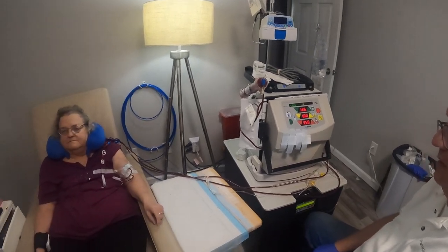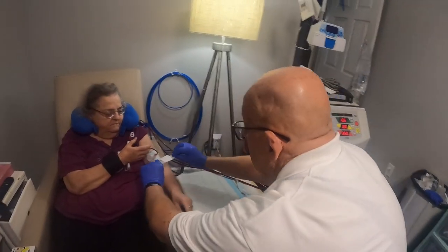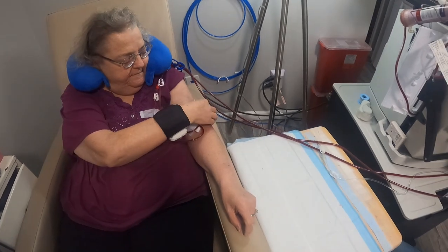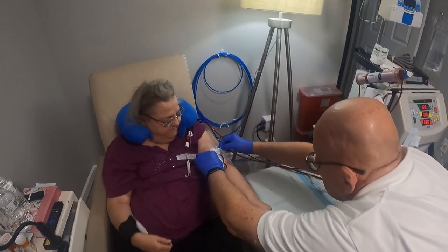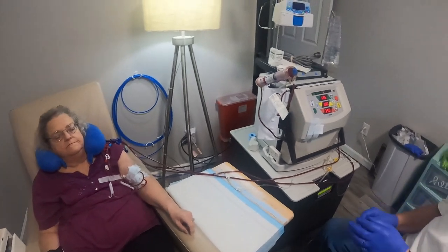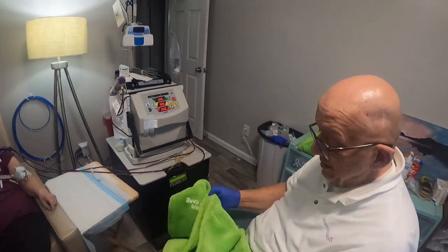Okay. All right. And then a couple of things you have to do after. One is for safety. You remember I said you need one gauze at the beginning? That's what this is. It's just for safety. If that thing starts bleeding, at least there's something there to catch it. She's in pretty good shape. We've given her her pillow. She normally gets cold right after we start.